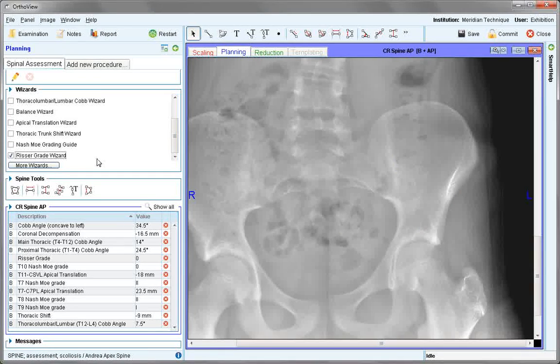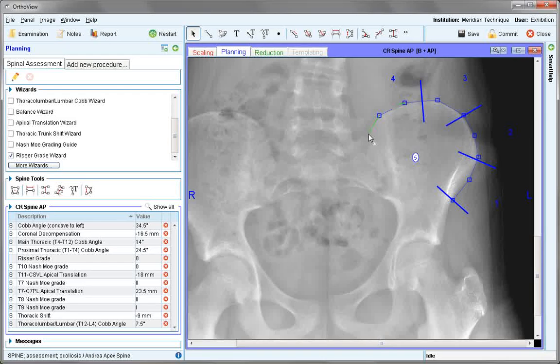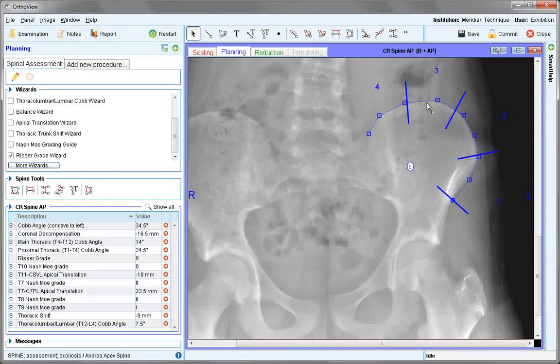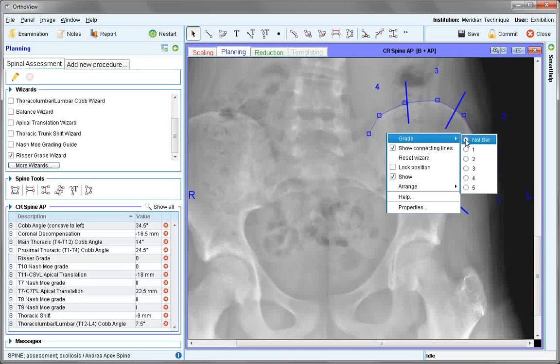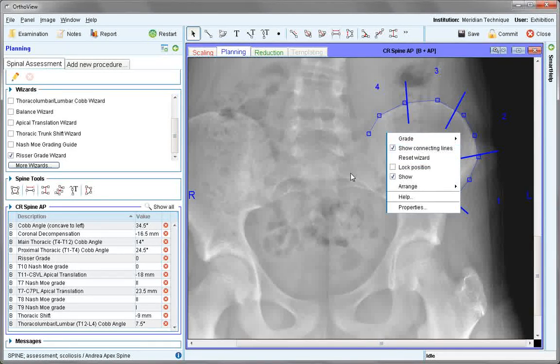Risser Grade is the final wizard. The wizard is not visible when first selected. It allows segmentation around the iliac apophysis depending on its maturity and its fusion to the ilium. Choose escape or double click to end the segmented line, which is broken into four sections. This has been given a grade of 5, however by right clicking any other grade can be set. It's also possible to reset the wizard if it's been difficult to position.